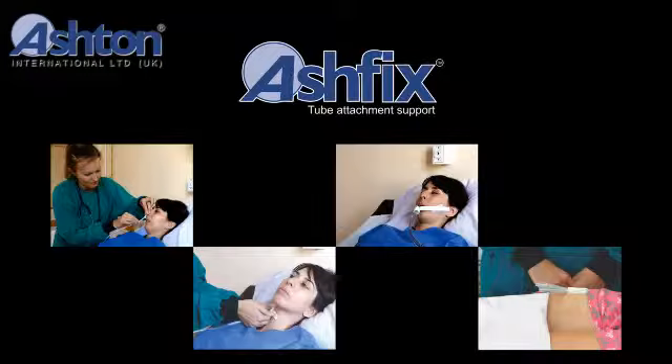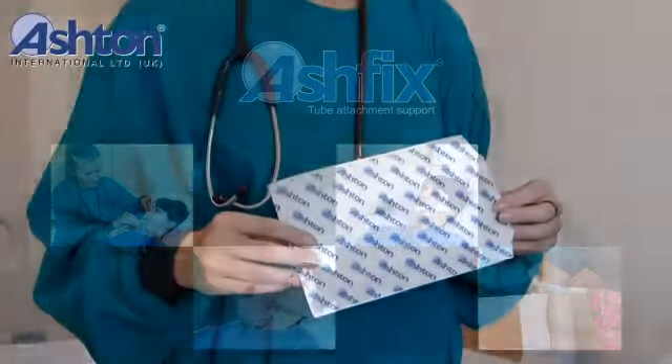This video will provide you step-by-step instructions for using Ashton's AshFix Tube Attachment Support. This will help your day-to-day use of the product.